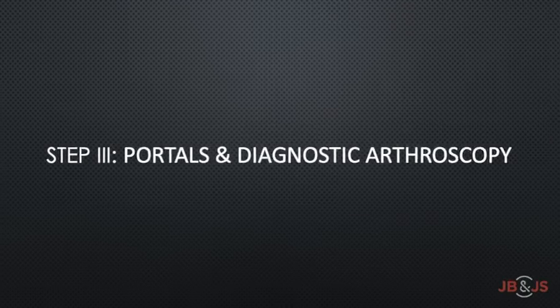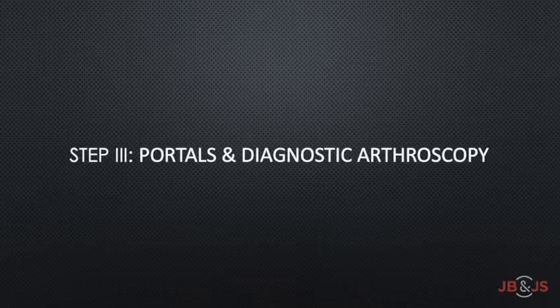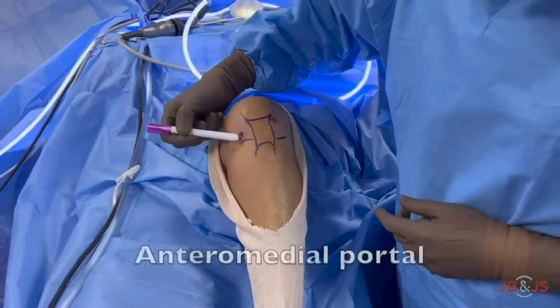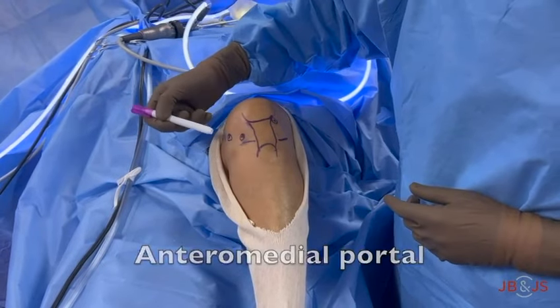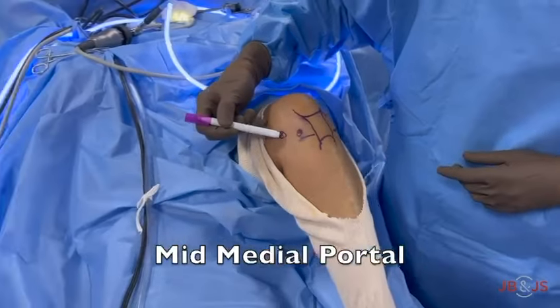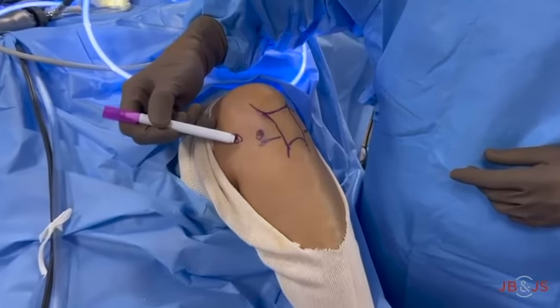Diagnostic arthroscopy is performed using standard arthroscopic portals. A high anterolateral portal is used as the viewing portal, while a low anteromedial portal along with an additional mid-medial portal made about 1 to 2 cm medial to the anteromedial portal are used as working portals.